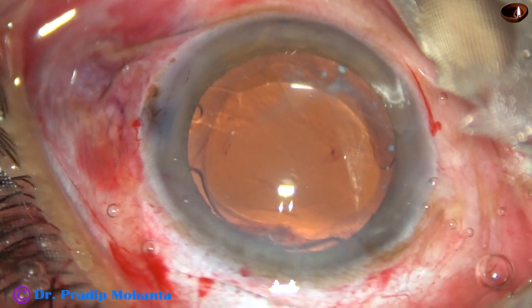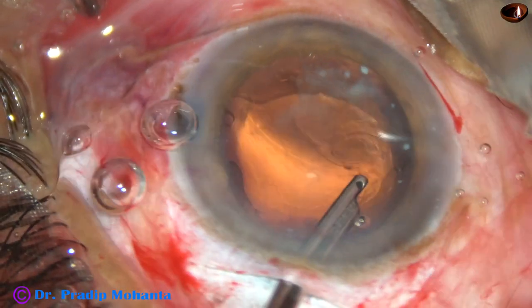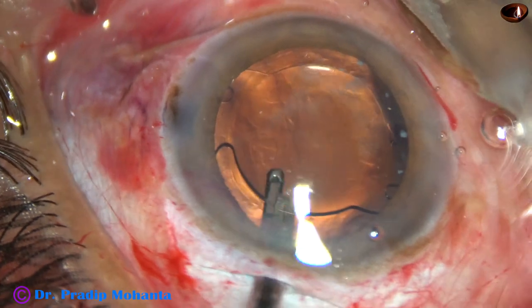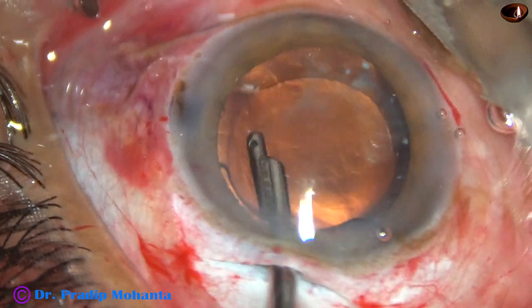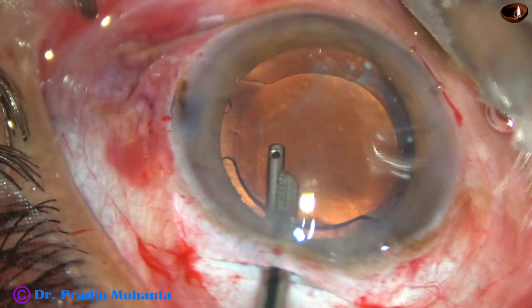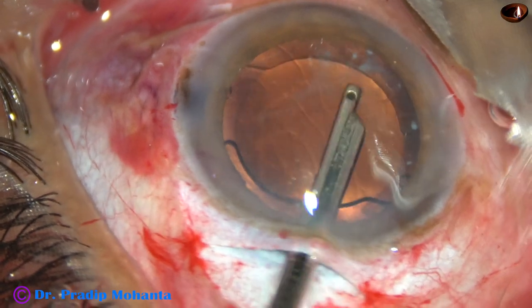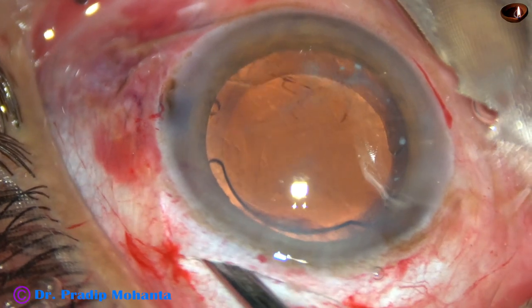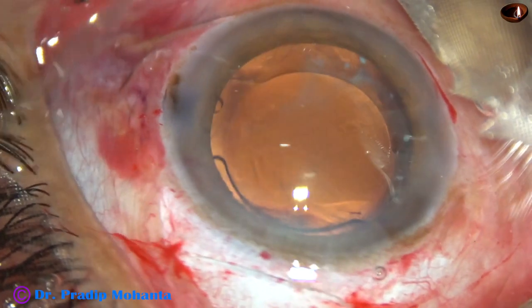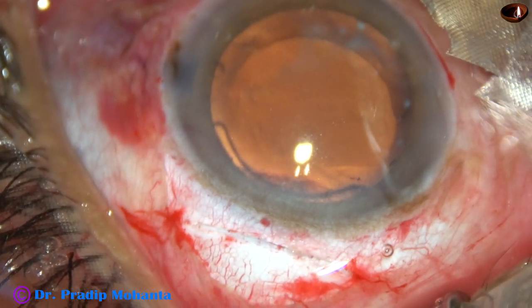Now our job is to remove the viscoelastic substance that we used for implanting this intraocular lens. Irrigate BSS — or whatever fluid you are using — for some time. Irrigate the capsular bag, irrigate the anterior chamber, and after some time start aspirating the viscoelastic substance. A nice job has to be done for every patient. I am just going to check if the wound will be nicely sealed or not — whether the wound requires any suture or not. No — it doesn't require any suture.